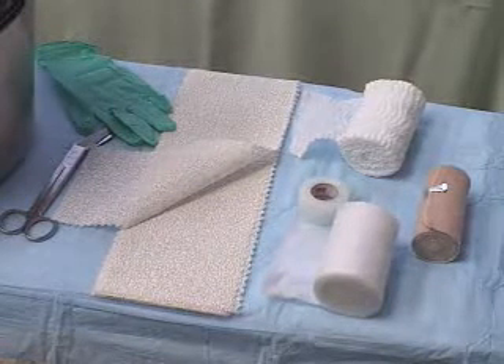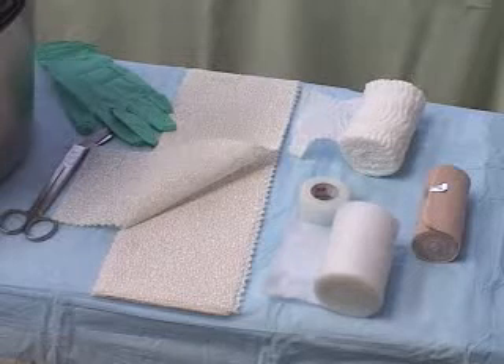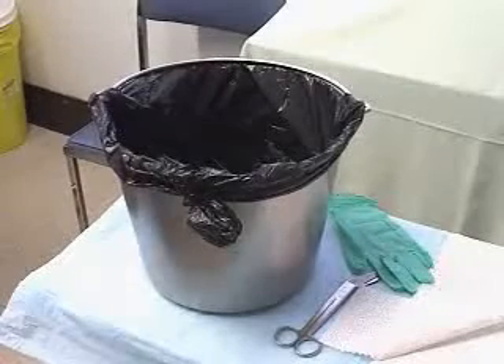For the simple volar slab casting, you'll need web roll, 3-inch plaster slabs, rolled gauze, and a bucket of warm water.